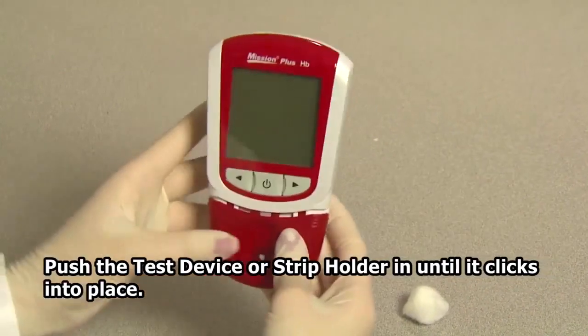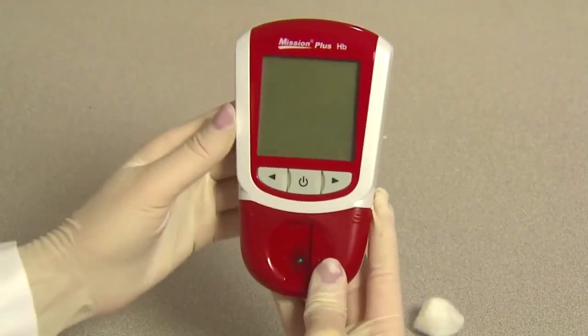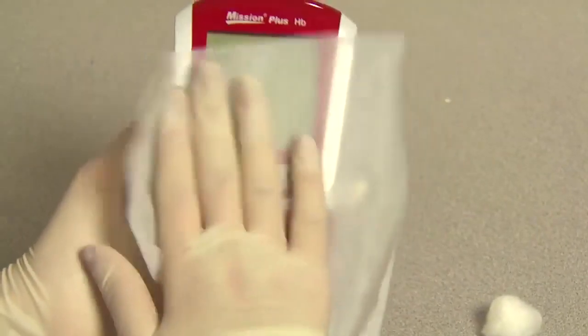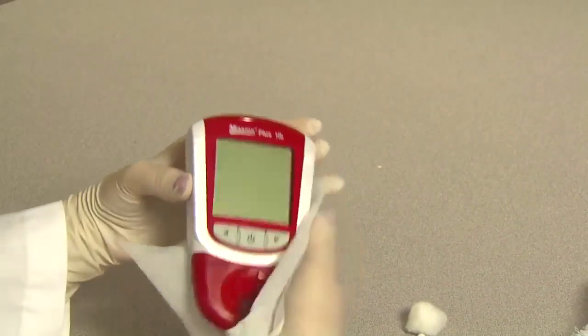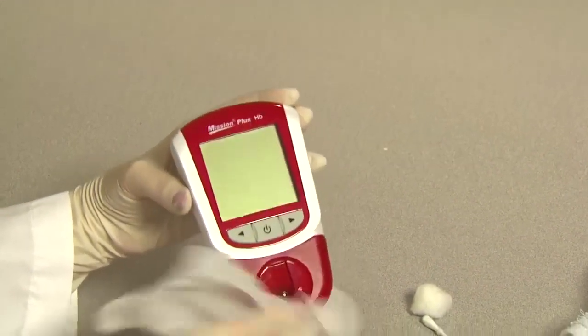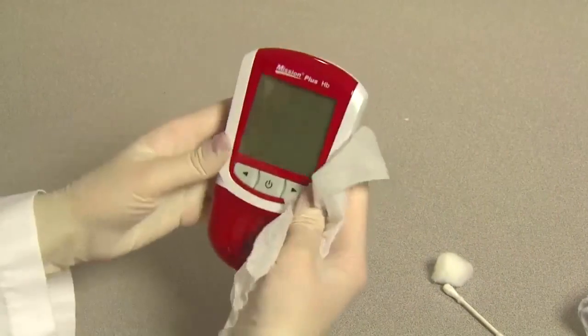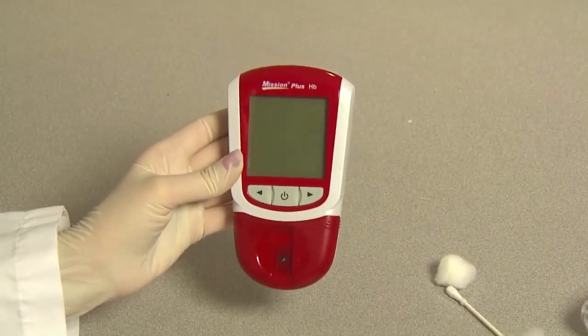If the meter is used for self-testing on multiple patients, it should also be disinfected before each test to prevent potential infectious disease transmissions through blood-borne pathogens. For disinfection, please use EPA-registered wipes with active isopropyl alcohol to wipe the meter. Be sure to wet the entire meter surface thoroughly and remove any stains or debris. The meter surface must remain visibly wet for 1 full minute, and then allow the meter to air dry completely before using it again.